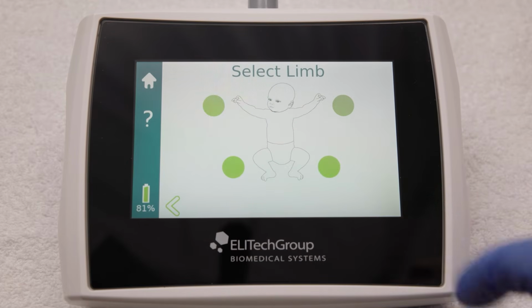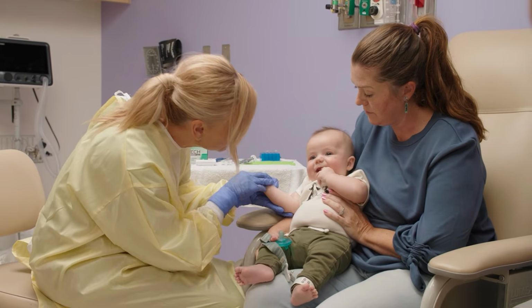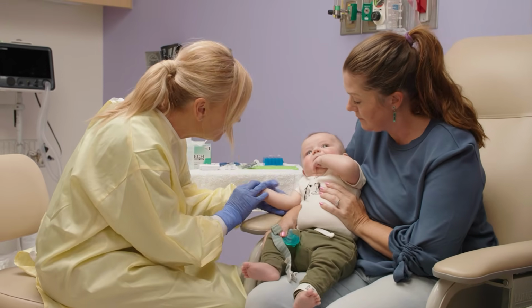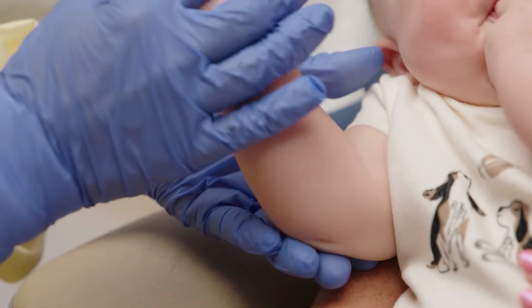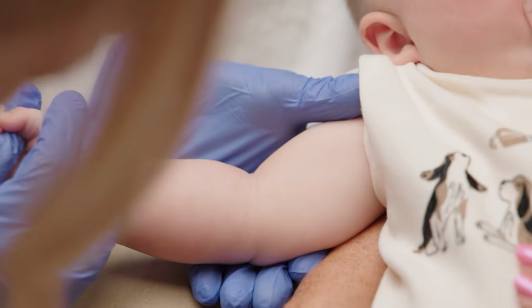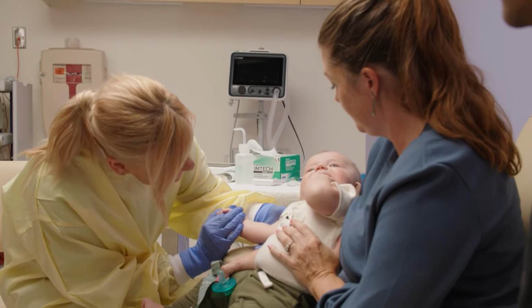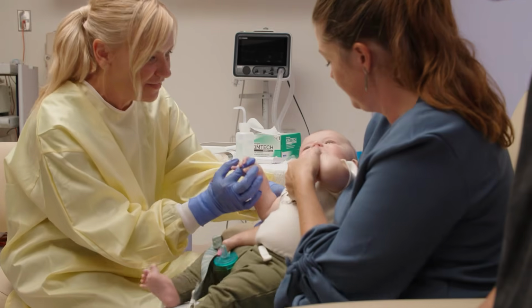Select the skin areas for electrode placement. The middle section of the inner side of the forearm is preferred as it has the highest density of sweat glands. Make sure the area is free of breaks, fissures, or other abnormalities like scars, as wrinkle-free and hairless as possible, reasonably thick musculature, and not too close to wrist tendons or bone. Also make sure the area is large enough for 2 electrodes.